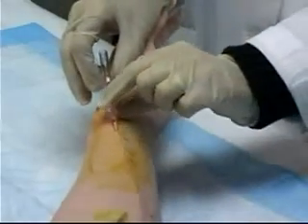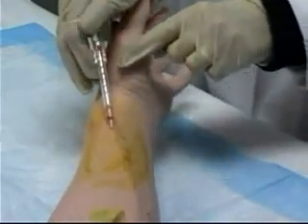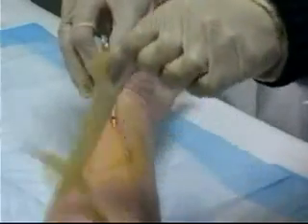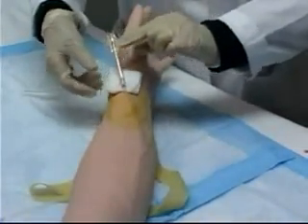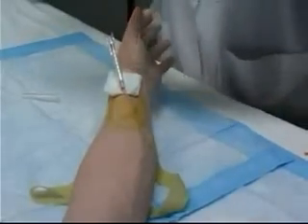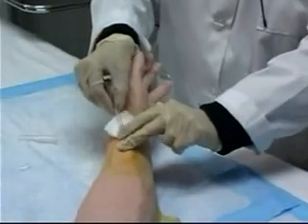Once I've completed that task, I can pull back on the protective covering until I hear it click. I now know that my needle's safely in my protective covering. Using one hand, I can undo my tourniquet. Bring my little piece of gauze over in case I make a mess, and connect my IV tubing to the catheter. Put a little bit of pressure over the actual IV.